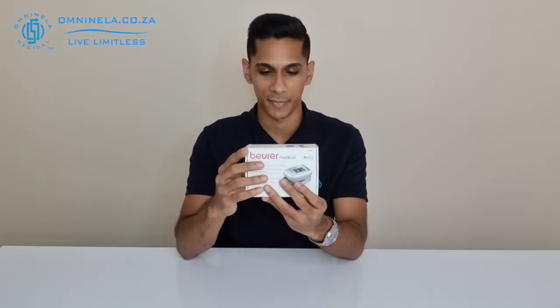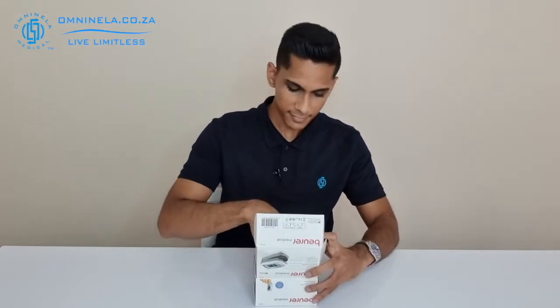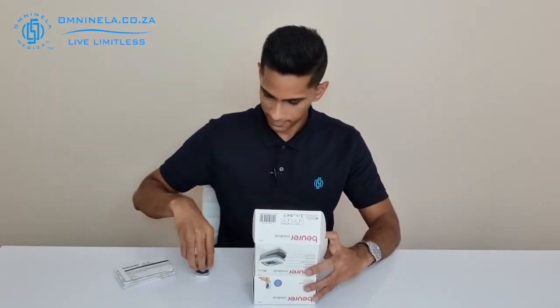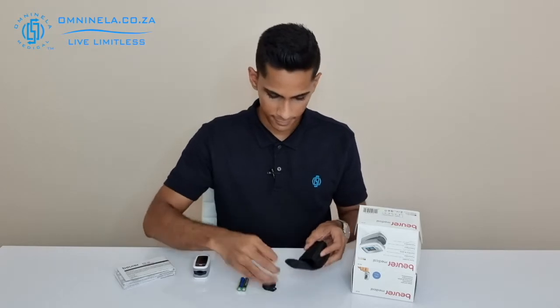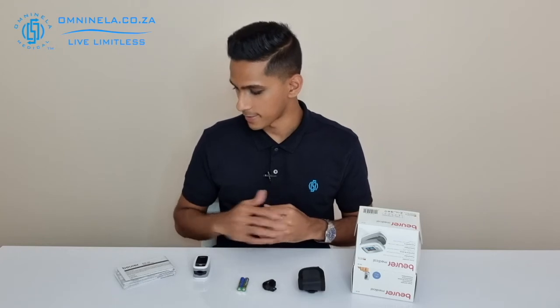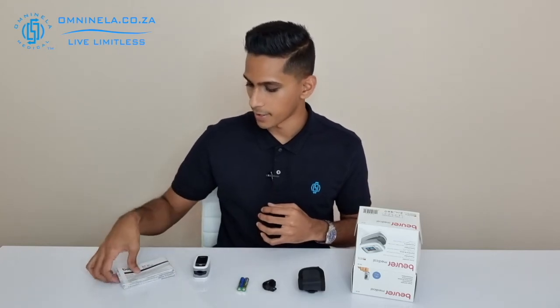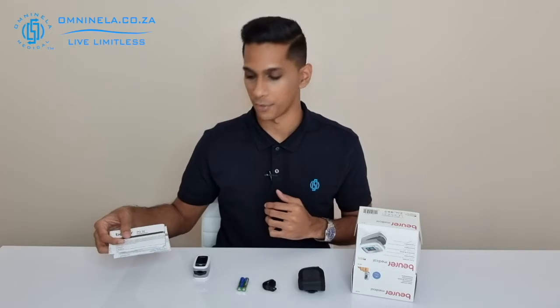Let's have a quick dive into the packaging and find out what is included in this box. Now that we've got everything in front of us, we can have a quick look at it. Immediately we're going to see that we are greeted by some of the instruction manuals and maintenance manuals.